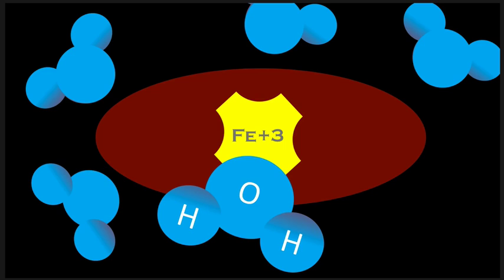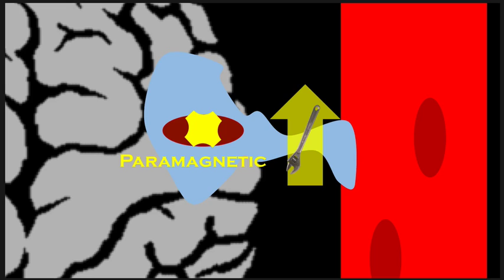They spin slower because they're not top heavy, and they therefore transfer their heat better, and therefore their T1 time is faster. Then they become T1 bright. And that is the reason why at this stage, which is now the subacute stage, that blood becomes T1 bright. It's because of that interaction of the water molecule with that methemoglobin, as opposed to the interaction that it has with the deoxygenated hemoglobin. That's the change, and that's why it matters.